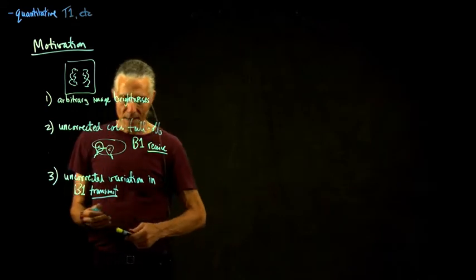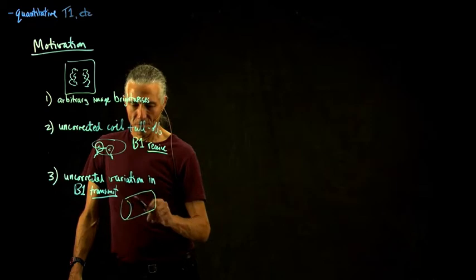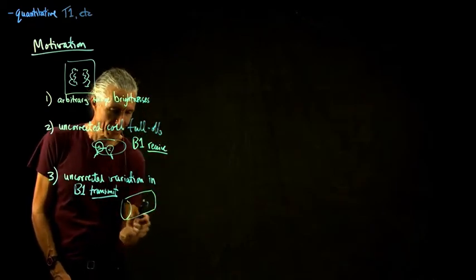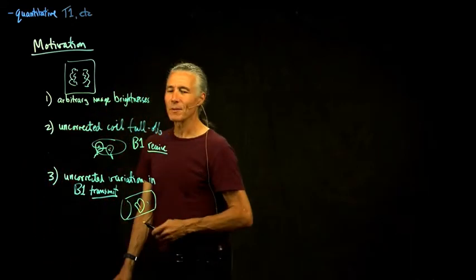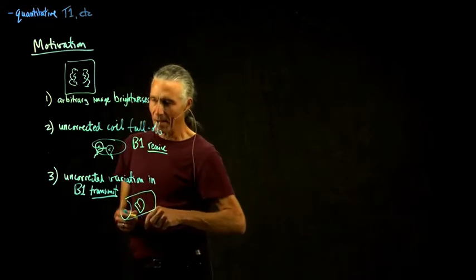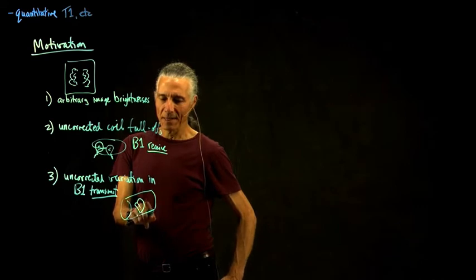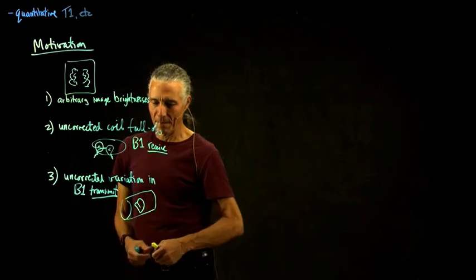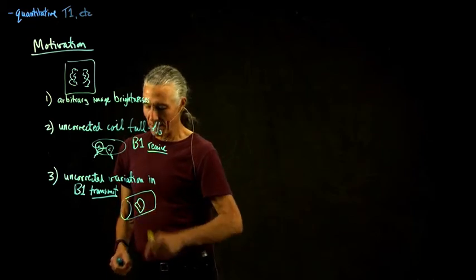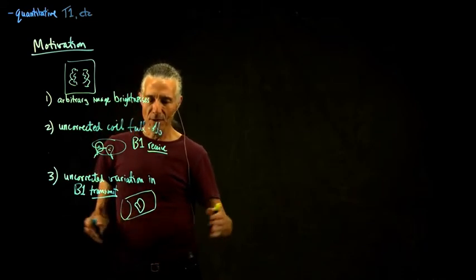And so even though the coil is very big and uniform, when you put the head in there, I drew it in the wrong axis, there we go, there's the better brain. So when you put the brain in there, the brain will actually affect how the radio waves propagate through the bore.